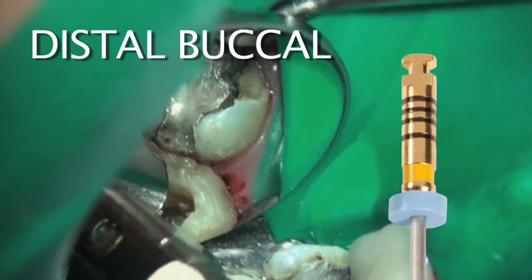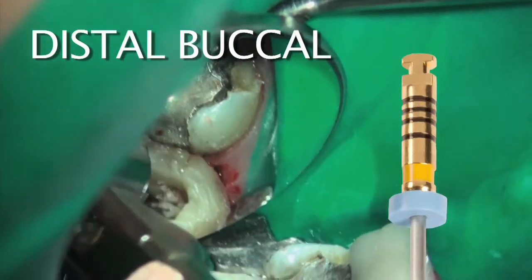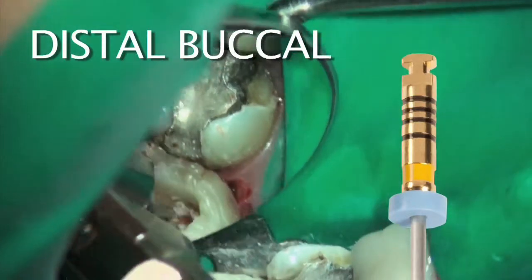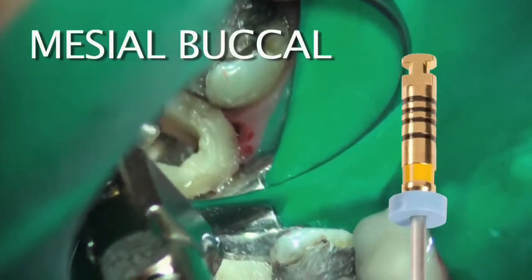I'm going to be bringing this instrument out soon and cleaning the debris off. What I want to emphasize is I use these out towards the line angles of the tooth. The slight finger pressure I'm putting on this contra-angle is directed out towards the mesiolingual line angle when I'm in the mesiolingual orifice.